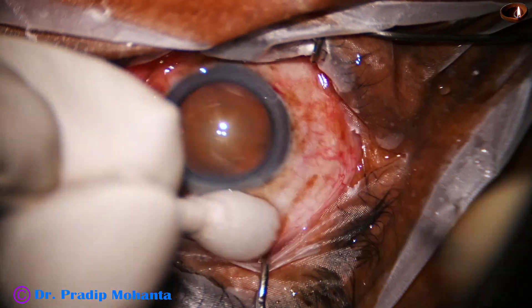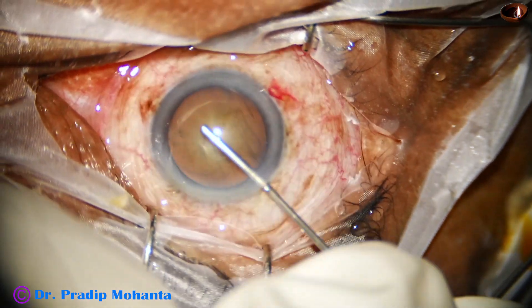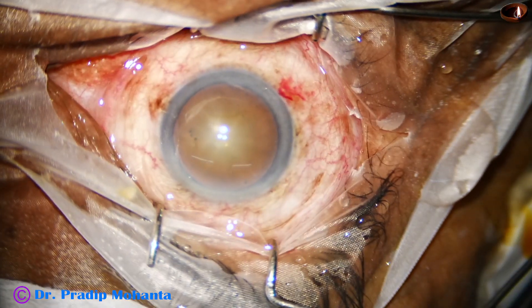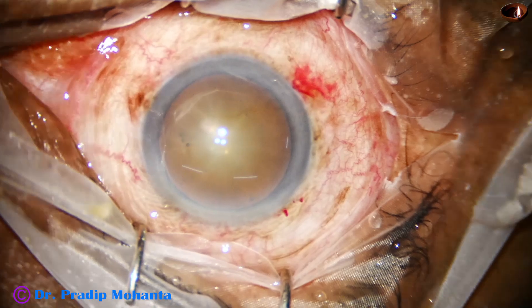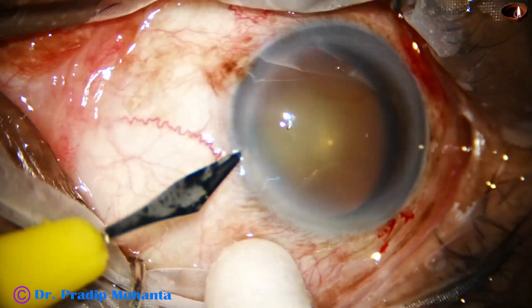The main incision is placed at around 11 o'clock and now the anterior chamber is filled up with visco. This is 2% hydroxypropylmethylcellulose. Now a side port is made on the left side of the main incision.